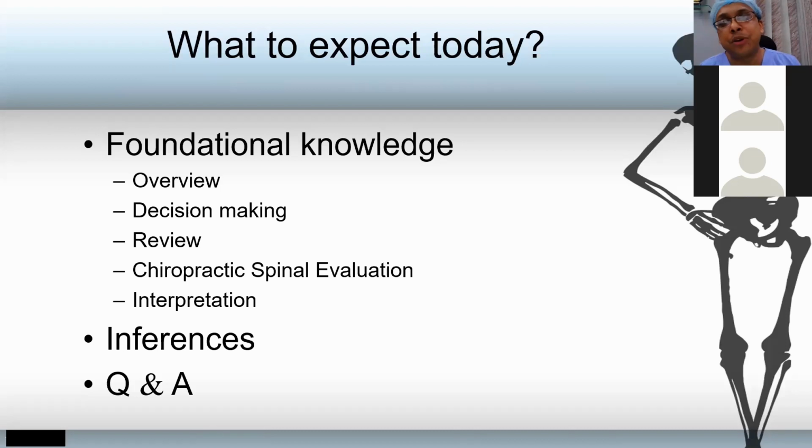Again, don't think that the chiropractic spinal evaluation content that I will be talking about today is just 10-15 minutes. It's a whole semester-long program, how you can interpret chiropractically in terms of X-rays of the spine, of other joints, and how you can mathematically compute certain geometrical differences or analysis. We'll touch upon a little bit of how, based on chiropractic evaluatory methods, you can measure the differences between certain bone edges in the spine.